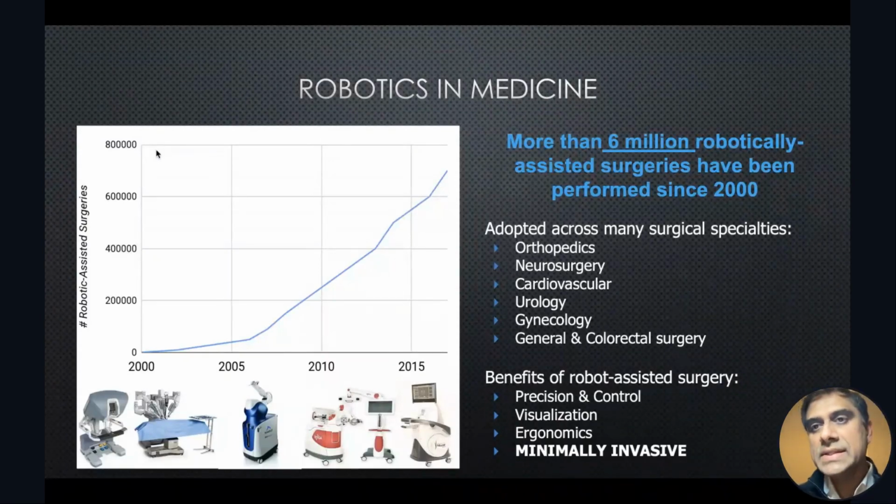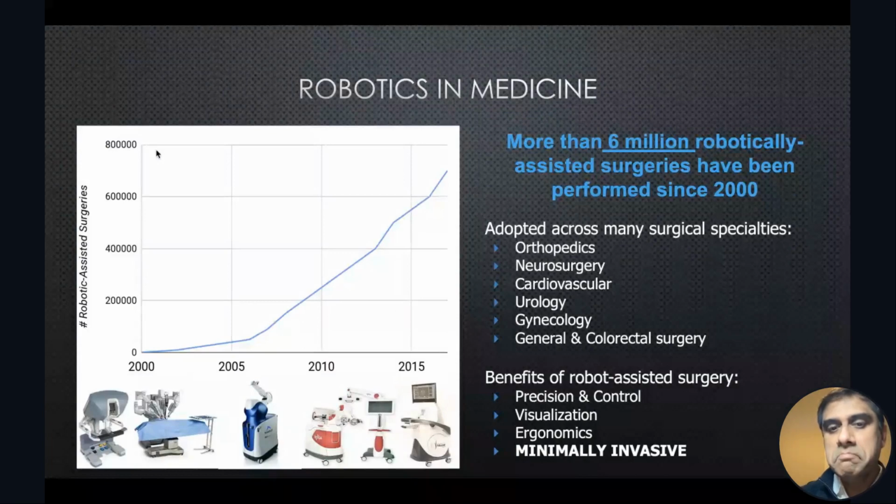As a comparison, when I used static guides, if I placed 100 implants, I would pay close to $30,000 to outsource to a third-party lab for those static guides.